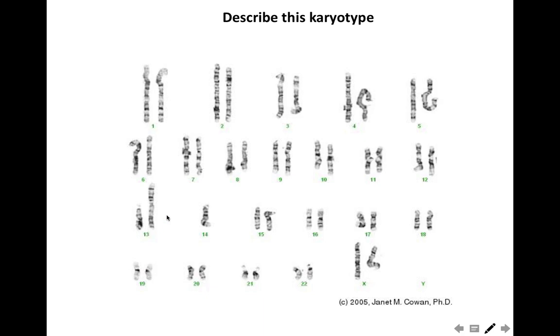So you can see here that one of the chromosome 13 is very long. And normally it's an acrocentric chromosome that should not have a P arm. So this means that this is another chromosome and it's actually chromosome 14 being attached to chromosome 13.